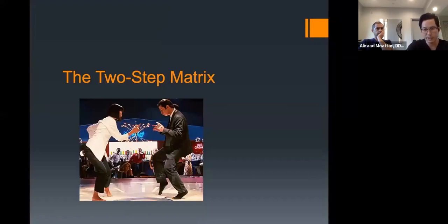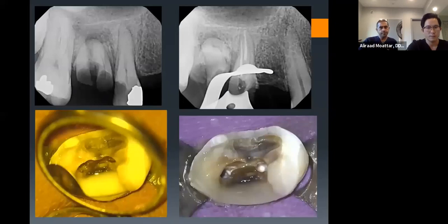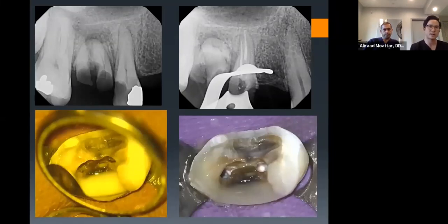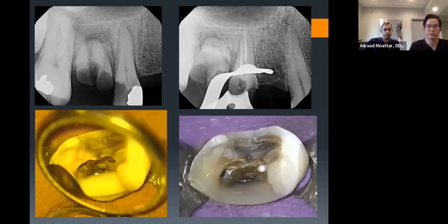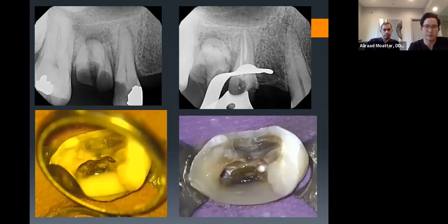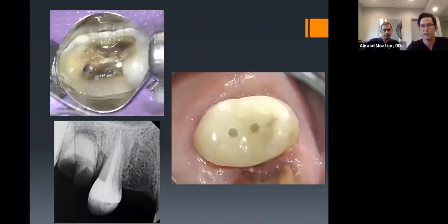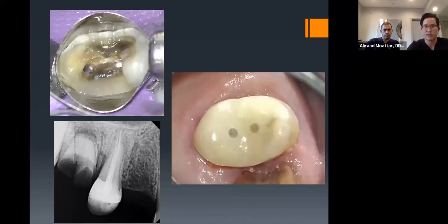The two-step matrix: when a Toffelmyer alone won't seal the gingival gap, rebuild part of the wall first with a sectional band, then wrap the Toffelmyer around the rebuilt wall. Added fiber posts, achieved a nice contour. The referring dentist can proceed with crown prep or whatever they want. When in doubt, go down the list of tools until you find what works.